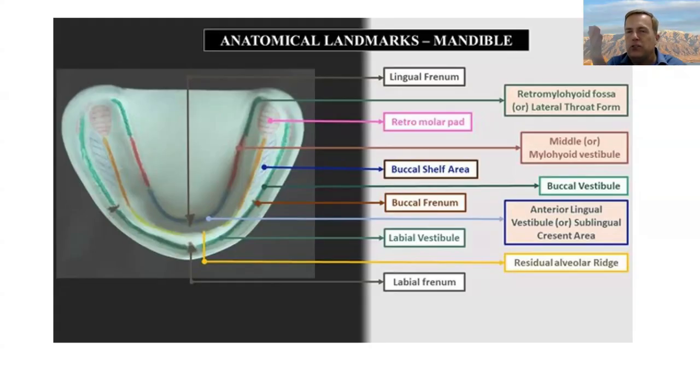And if you want, you could just trim them a little bit. Say, hey, I noticed a little overextension on the posterior left there. I trimmed it up a little bit. Please follow this for the final. Make sure you pick up that buccal shelf. As you know, that's a great load bearing area. So the broader we get on that, the more stable, relatively speaking, our mandibular denture is going to be.